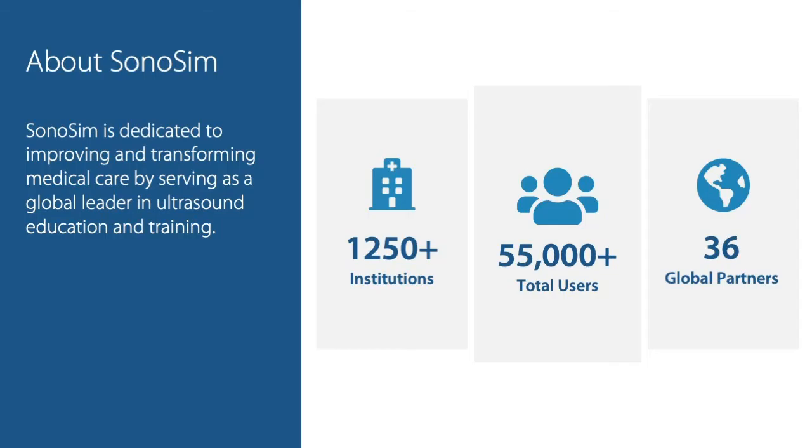So a little bit about us at SonoSim. We are dedicated to improving medical care by serving as a global leader in ultrasound education and training. So we really have a wide footprint, and there's a lot of people utilizing this technology. So we really wanted to create a product that enabled a well-rounded learning experience. It's really about making sure that you have the opportunity to learn on your own at your own pace, that you have the opportunity for a lot of scanning whenever you have the opportunity to scan, that it's available to you, and standardizing the pathology exposure.